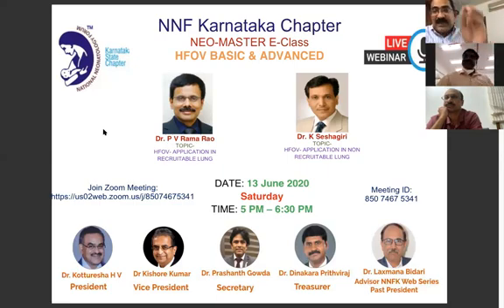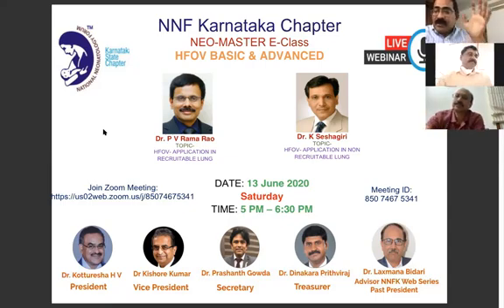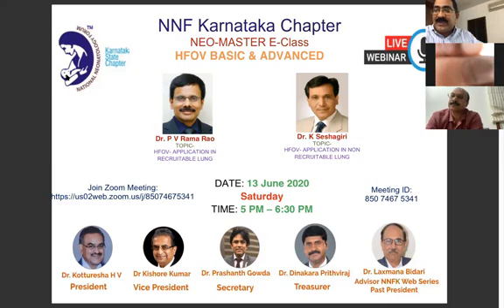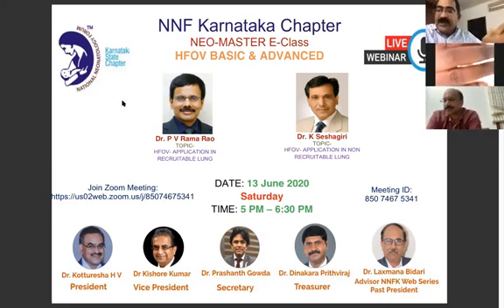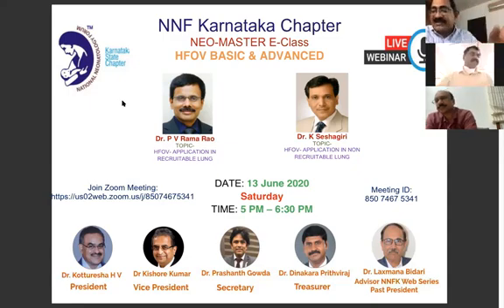So that is what I'm saying. For the first 1 hour, all you need to do is get the baby on the vent, recruit the lung, know what the critical opening pressure is, know what the critical closing pressure is, then get the baby onto the deflation limb of the pressure volume loop. So you don't get a number straight away. I hope it is a very long topic, but I hope I've answered your question. Yeah, sir, critical opening pressure or critical closing pressure, everybody knows it.